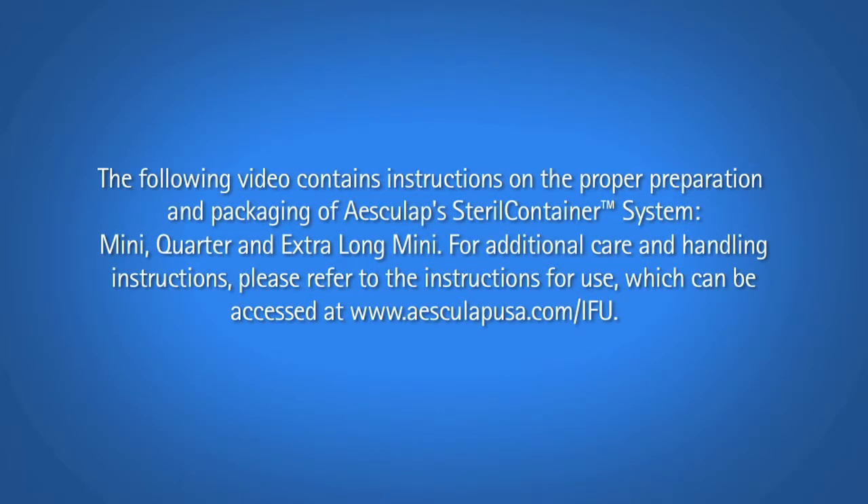The following video contains instructions on the proper preparation and packaging of Aesculap's SterilContainer System: mini, quarter, and extra-long mini. For additional care and handling instructions, please refer to the instructions for use, which can be accessed at www.aesculapusa.com/IFU.